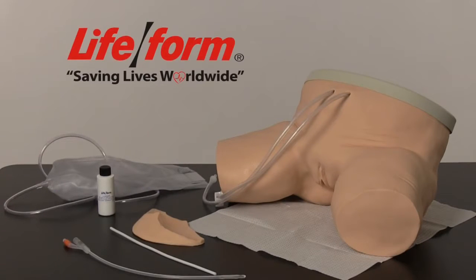The Lifeform Female Catheterization Simulator is designed to duplicate the human condition as close as plastics technology allows. This video will assist users in the function, care, and maintenance of the simulator.